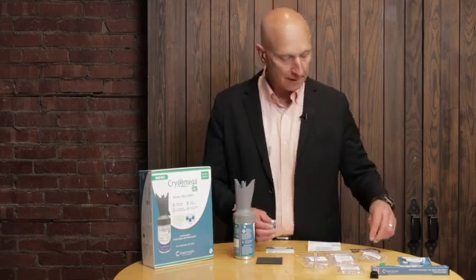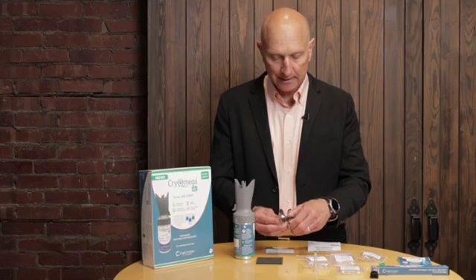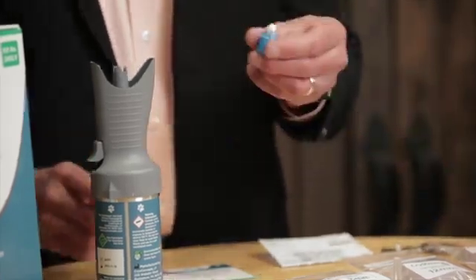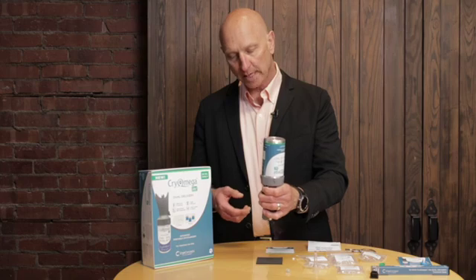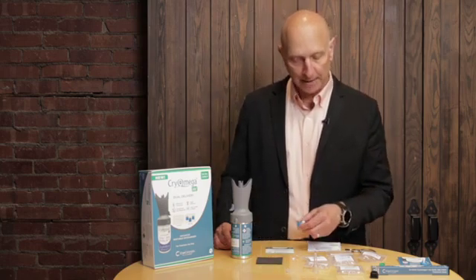And if you have a lesion which is small and you don't want to use the full size of the tip, this can easily be trimmed to whatever size is necessary. And if you're treating multiple lesions, simply go back to the canister, add more gas, use, and when done with that patient, this again should be disposed of in the normal trash.